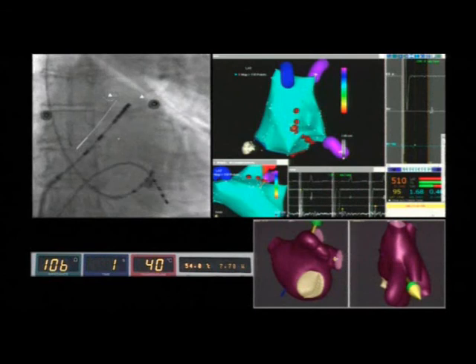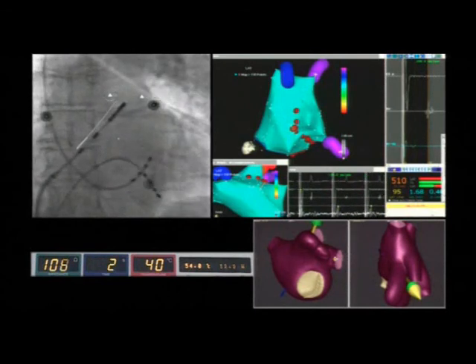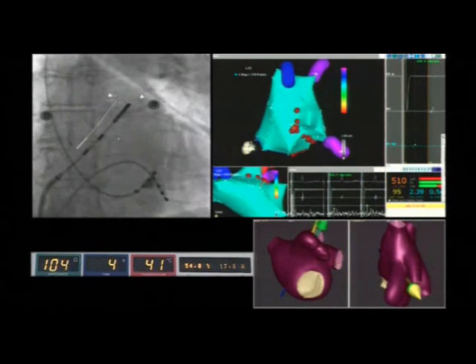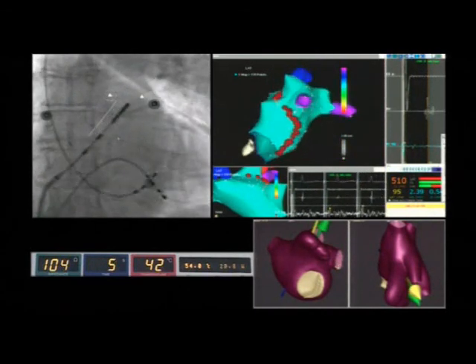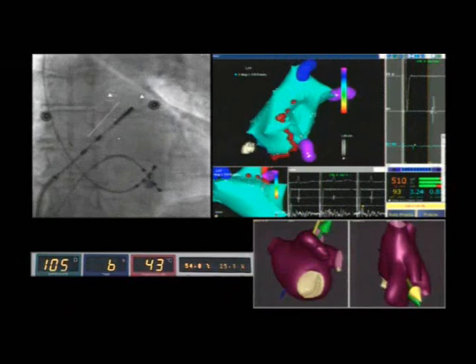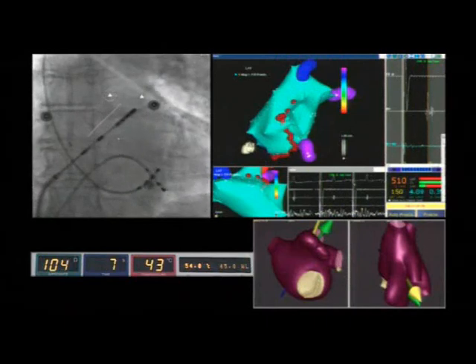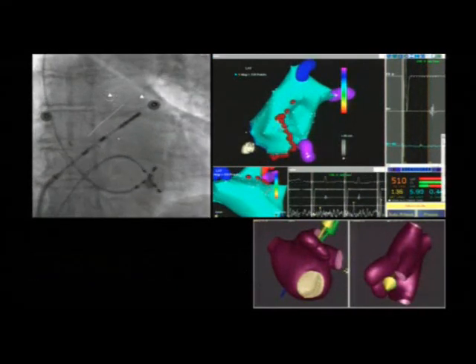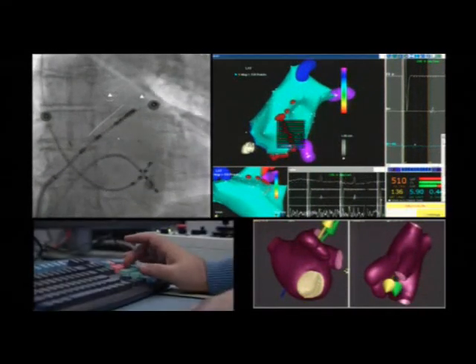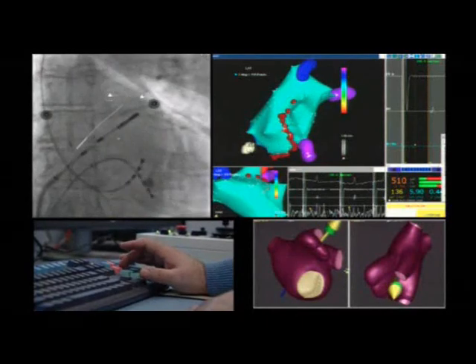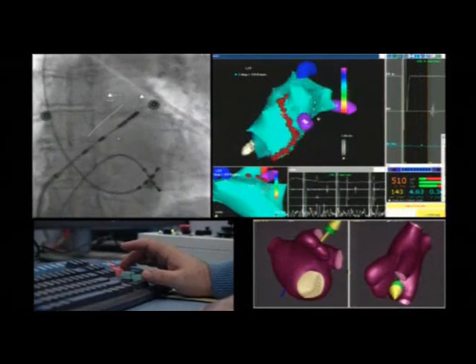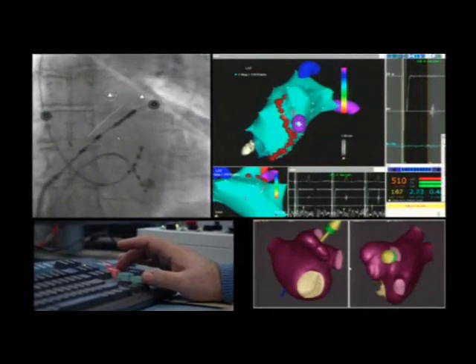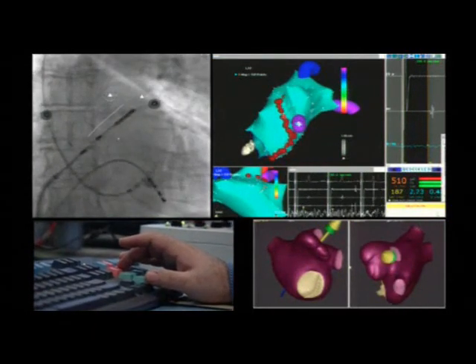In such cases, we prefer to deliver repeated radiofrequency applications of short duration instead of a single radiofrequency application of a duration greater than one minute, to avoid the risk of cardiac perforation.